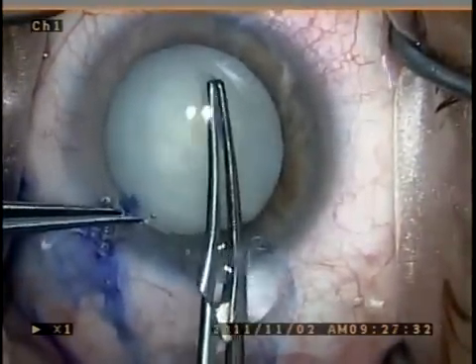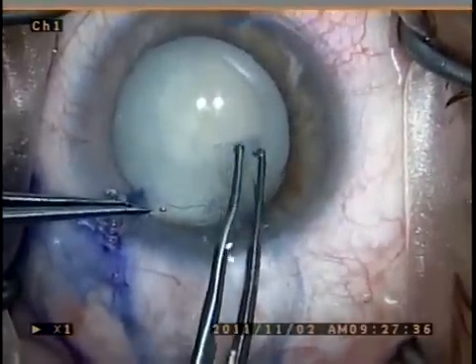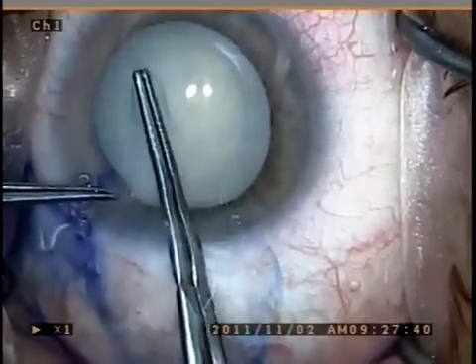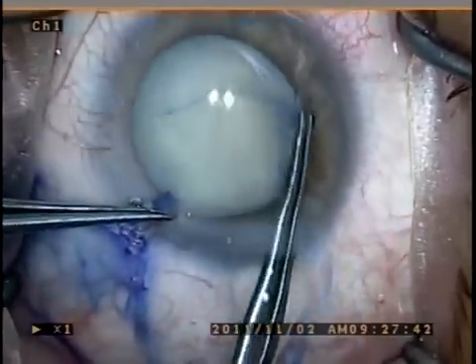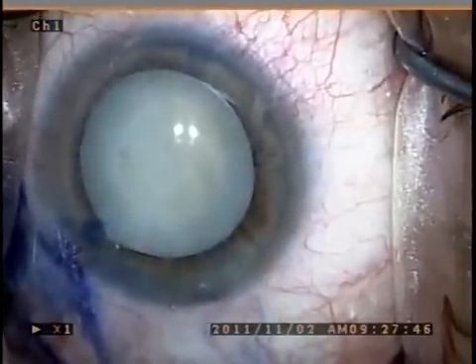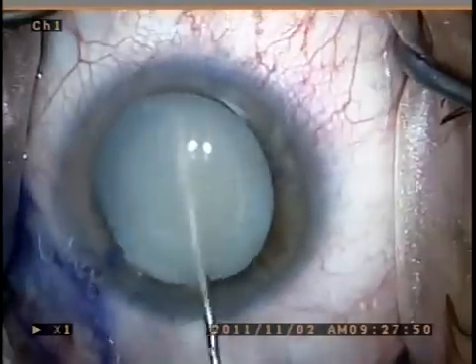This decompresses the lens and prevents the upward pushing of the anterior capsule with the liquefied cortex and the possible disruption of the circular capsulorhexis, which can then be performed quite easily.